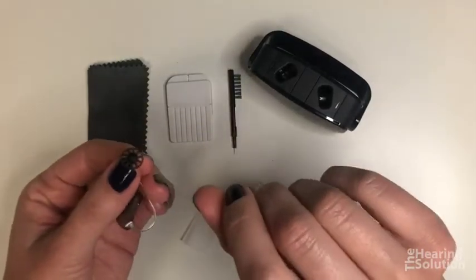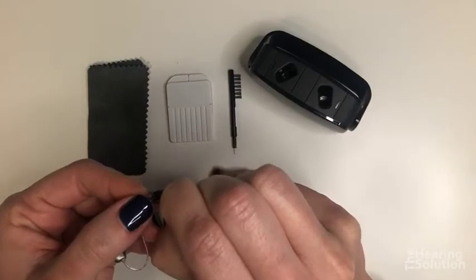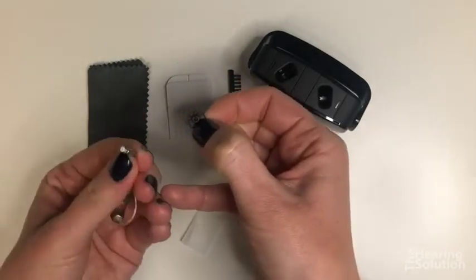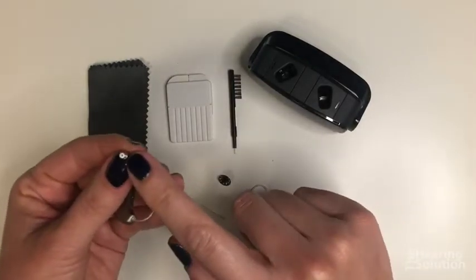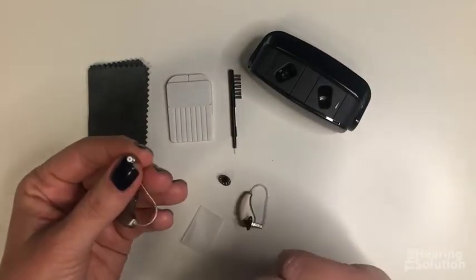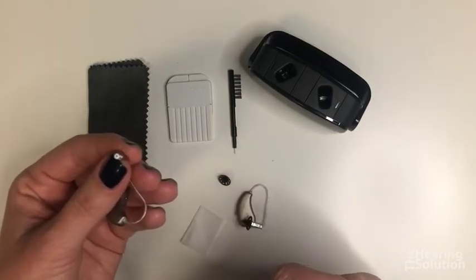The next step is to remove the dome. Just grab it by the side and peel it off the end of the speaker wire. The small white part at the tip is where the sound comes out, and that white piece is called the wax filter — we'll need to change that.